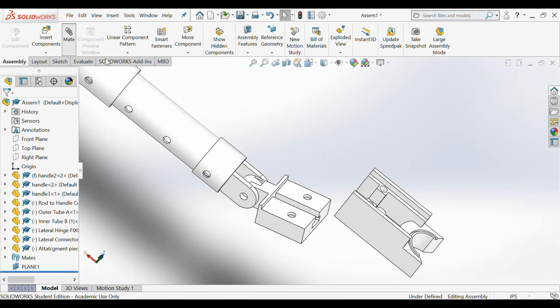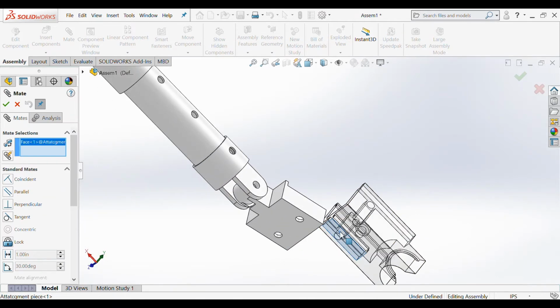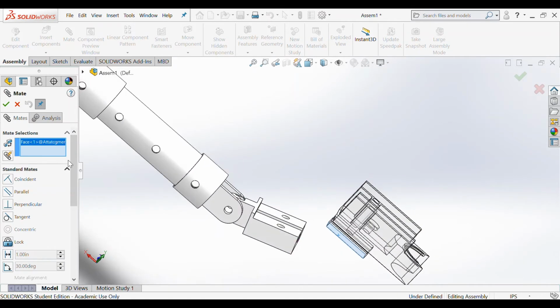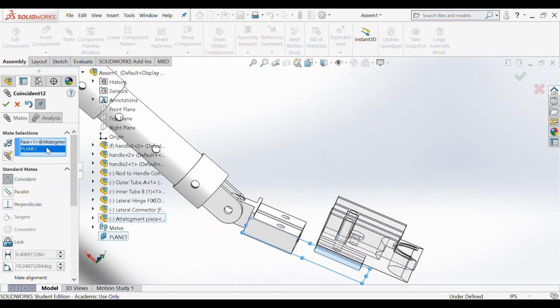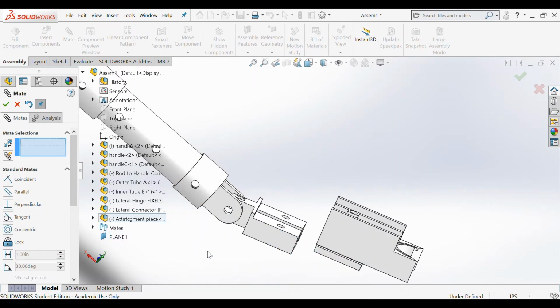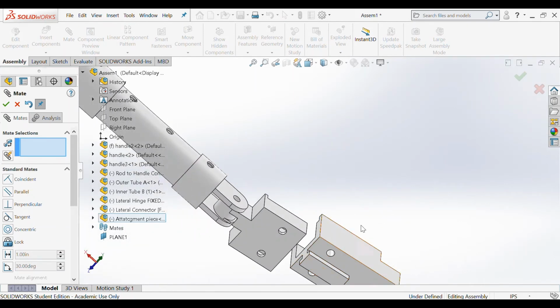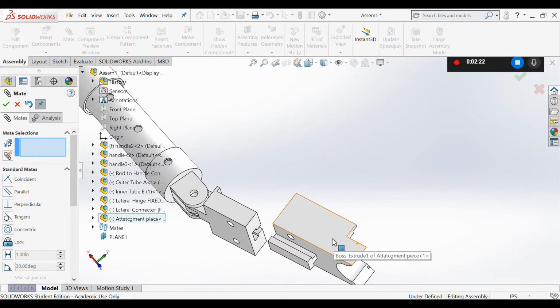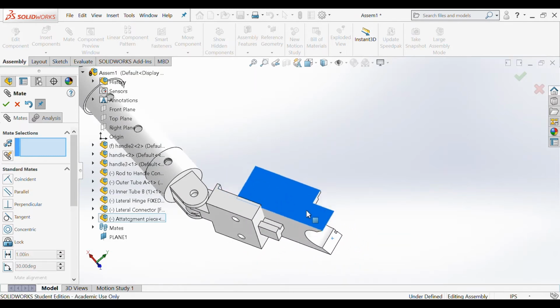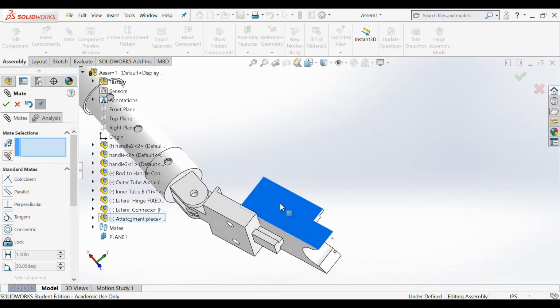And so we're going to go back to our mates, and we're going to click right here on the bottom of our piece, and then we're going to choose to make this new plane that we've made and the face coincident. Now, instead of making the face itself and the bottom of this piece coincident, I've decided to make it with a plane because the whole point of our device is for the end piece to be detachable. Now, if we made those two coincident, we wouldn't be able to move it like so.